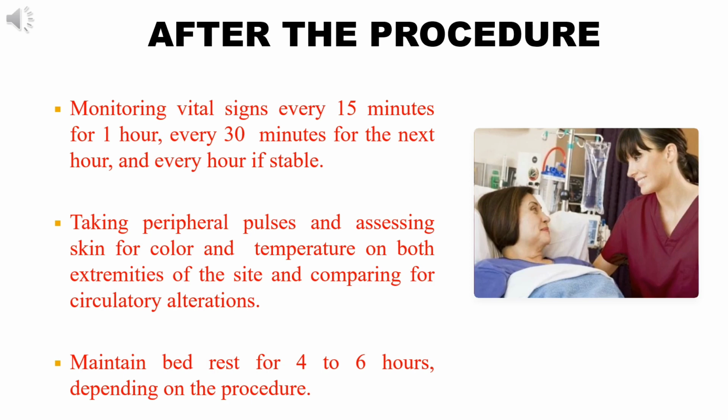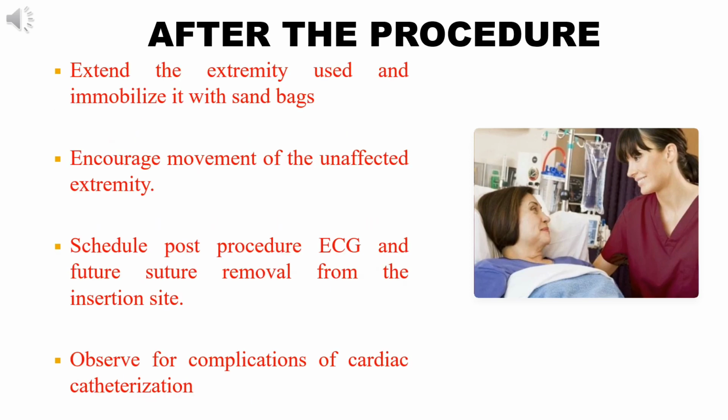Extend the extremity used and immobilize it with a sandbag, and encourage movement of the unaffected extremities. Schedule the post-procedure ECG and future suture removal from the incision site, and after that observe for complications of cardiac catheterization.